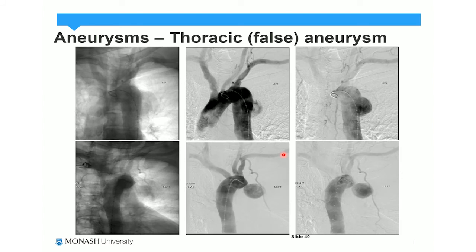So here's on angiography. This is a standard kind of LAO projection with a pigtail catheter. We're seeing filling into this aneurysm. Remember, we don't see the thrombus around the outside. A reverse oblique is showing a little narrowed entry to the aneurysm with filling.